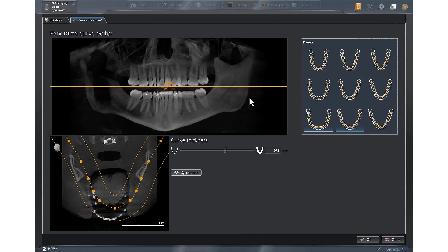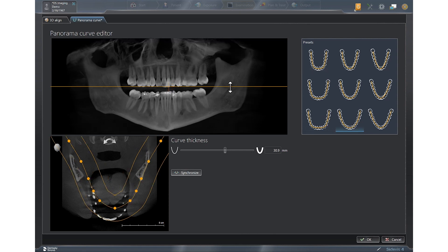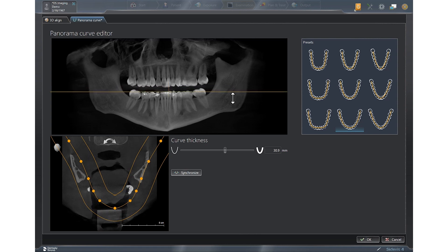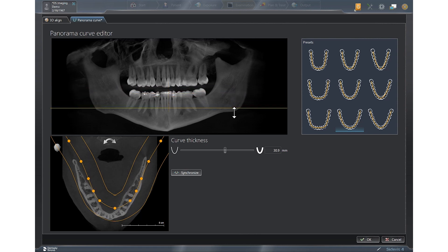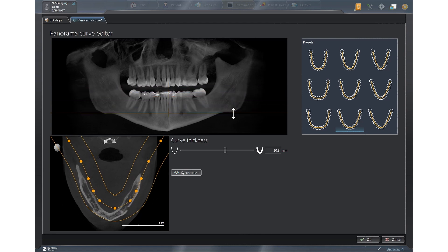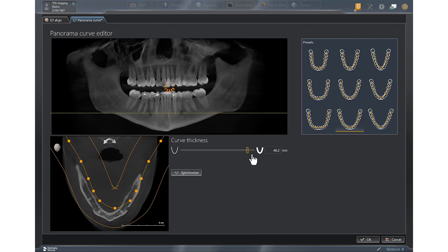Second, we'll come over to the pan window and drag the orange line down to the area of the mental foramen. Next, we're going to go to curve thickness and drag this all the way over to the right.